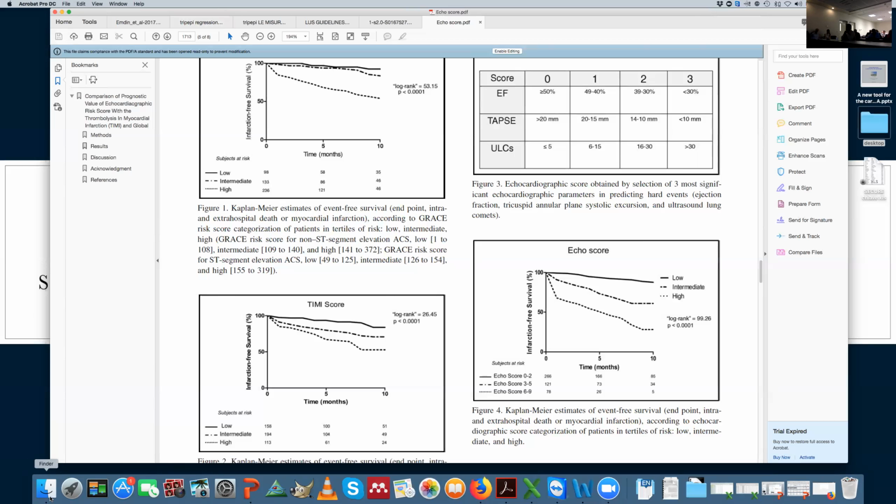I say that probably this patient was the one you were speaking about a few minutes ago, very sensitive to B lines. Yes, it is exactly, I mean, this is a surrogate for an ischemia test, and it's true, we saw this in many patients during stress echo. I agree with you that it's quite astonishing the first time, because you don't expect them to be so dynamic, not only in going away, but also in coming up.